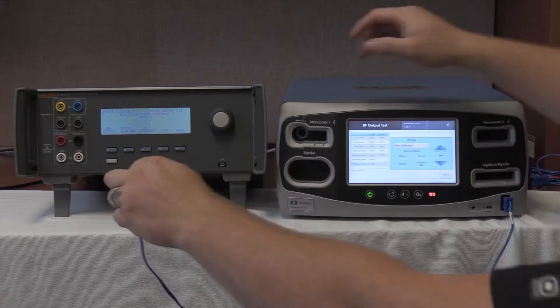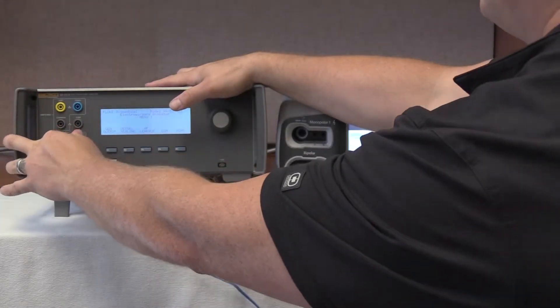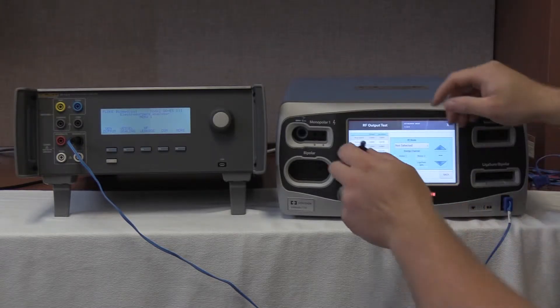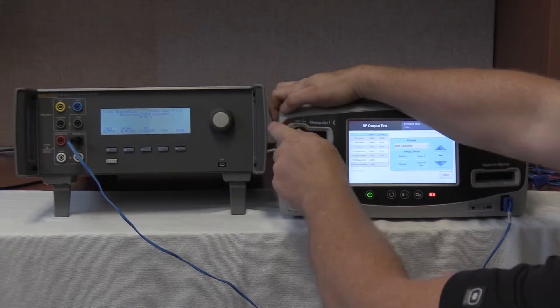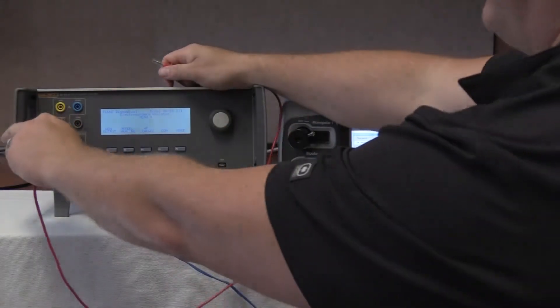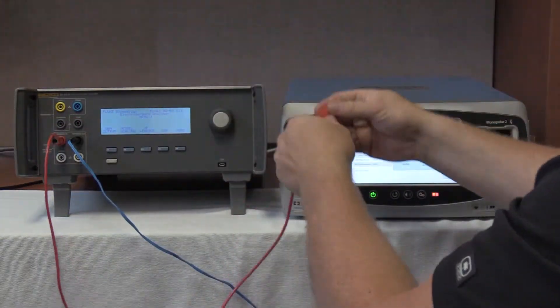This will now go to the variable low of the QA-ES III. Then we are going to take our second cable and connect it to the output jack from Monopolar 1 of the Valleylab FT10. And use our red cable to connect the variable high to the handpiece adapter.